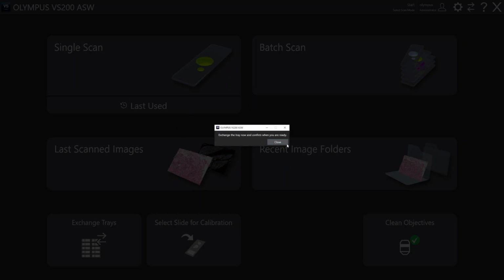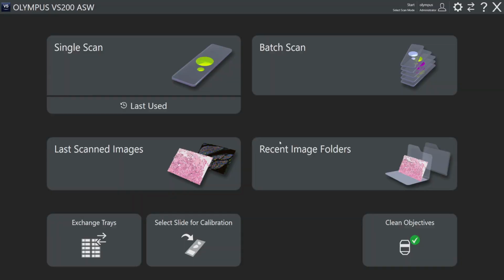Now we will wait a few seconds until that updates and close the instrument door. A few notes here. The first is that you don't need to calibrate the instrument. That will be done by a specialist working at CARF.